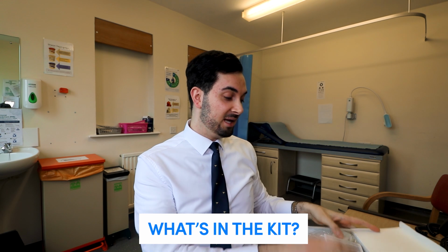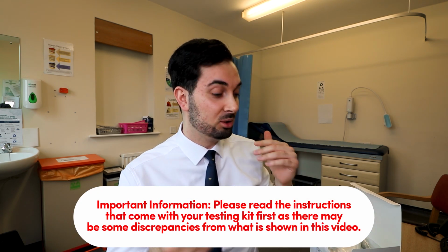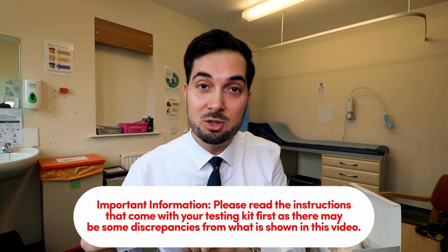Okay, so let's first start with the kit. Look, the most important thing when you open any kit is whip out that instruction leaflet. This is the most important part of any lateral flow test kit that you use. Whether it's the IVD one that I'm using, or if you're using a different one, please first open this information leaflet and read the relevant part on how to use it, because all of them do vary slightly. So get yourself read up and clued up on the information leaflet, and also watch this video, but don't entirely rely on everything I say on this, because your kit might be slightly different and you're going to be able to incorporate all the information from the leaflet and mix it into what I'm saying, which is going to help you understand how to use it properly.